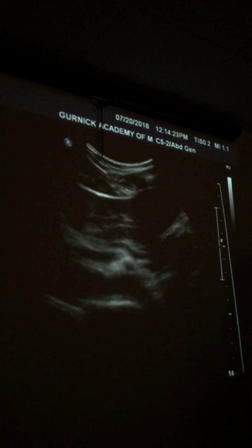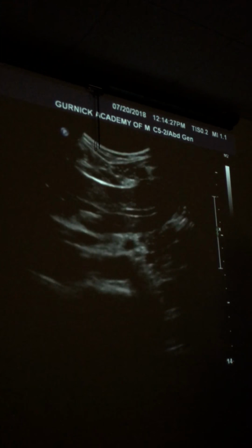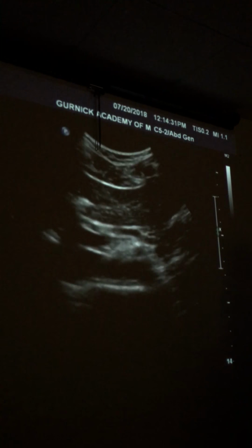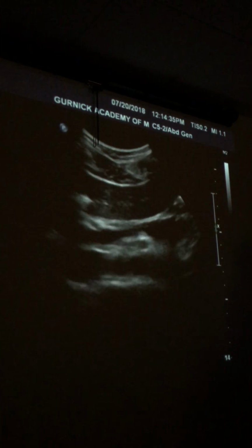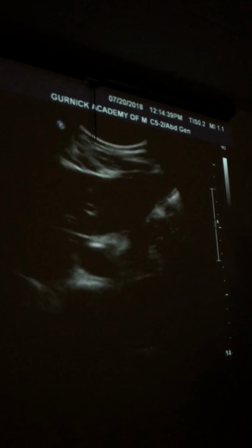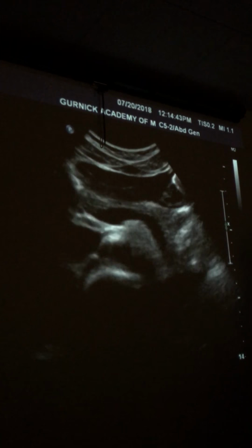What two branches are these? Good, good. So that's okay. I want the seagull. How do you want it, Stephanie? I want the seagull. You'd rather have the seagull more than the trunk? I want both. I wanna see the trunk coming off and I wanna see the seagull.